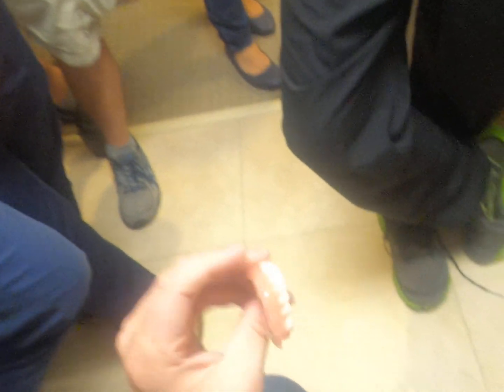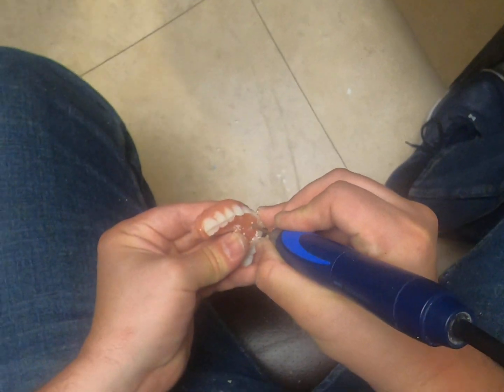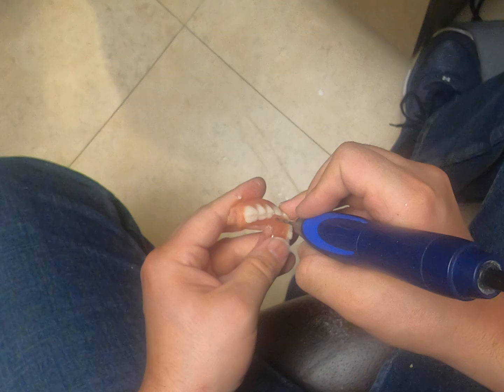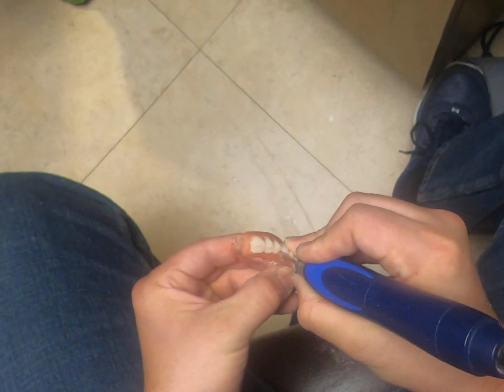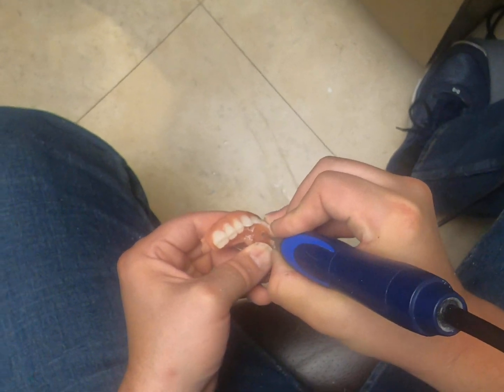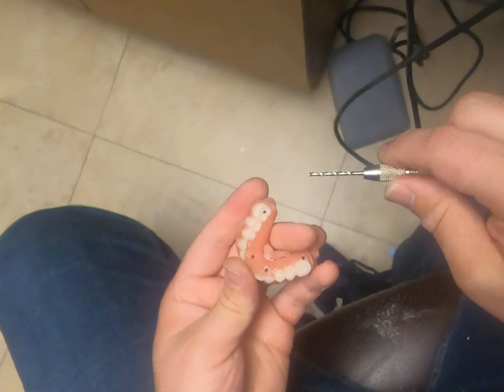The bigger holes were broken. This one's not breaking. I might have a tooth pop out because I used denture teeth, but the base — sometimes I'll have them mill out an arch. You can mill it all in acrylic and it's solid. We can extend the flange — it's like how you trim it. The only problem is the white side. That's why I like processing the pink flange, so that as we grind this down we won't have to do too much doctoring up. They are more likely to break if your restorative space is very small — minimal, always.